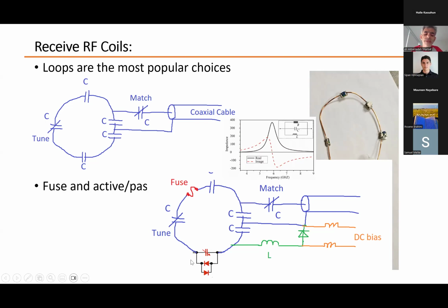So here there is another safety step actually. We have a capacitor in parallel with 2 cross diodes. So when the current induced inside the loop is small, everything works just fine, no problem. These diodes don't do anything. But if the current goes higher than a certain limit, the voltage drop across the capacitor increases.